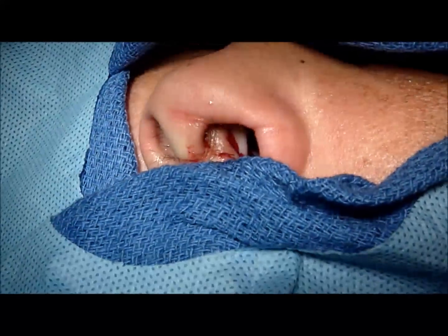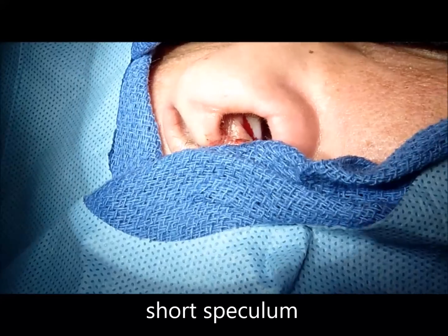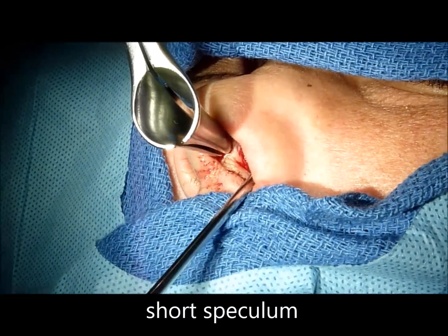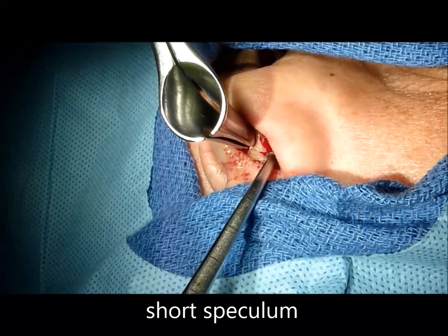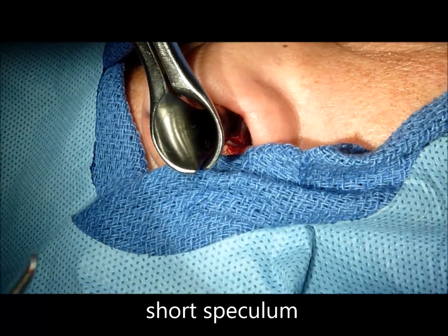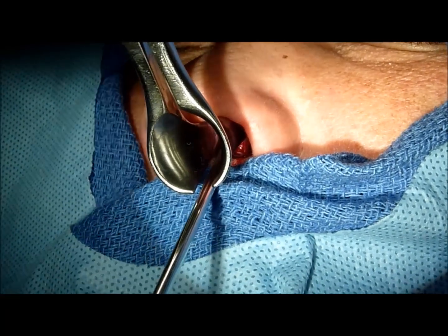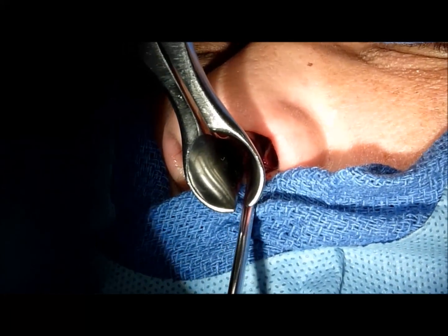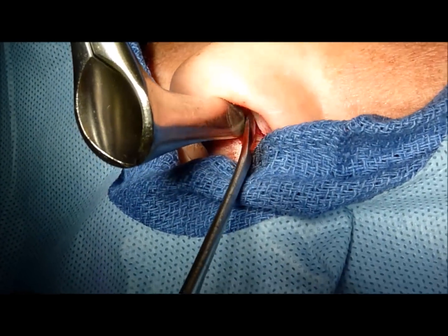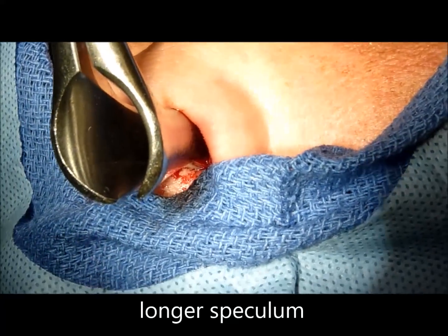Once we have achieved a pocket in the anterior aspect of the septum, we can then introduce a short speculum to allow us to visualize within the nasal cavity below our flap to help guide our dissection, both traveling superiorly as well as inferiorly, elevating the mucosa as we go, working our way slowly deeper within the nasal cavity. We can switch to a longer speculum as we get deeper so that we can elevate the mucosa all through the nose.